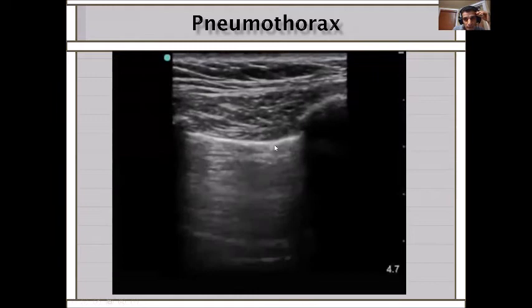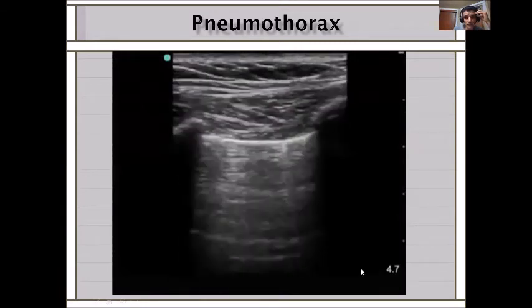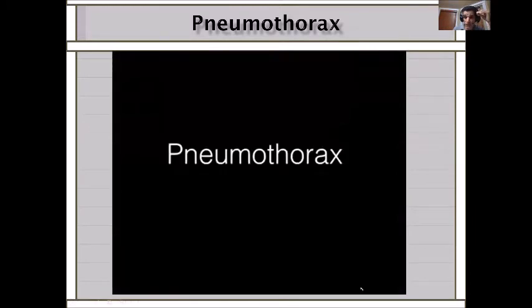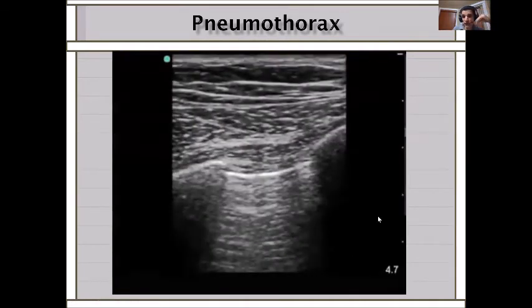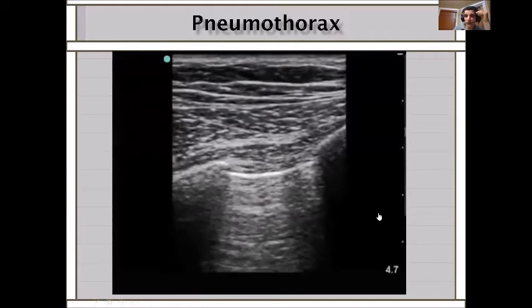Look at this line. Remember this line. Don't look at the whole picture. Look at the pleura and look at this line moving. This one. We'll see more clear. Now look at the pneumothorax. Look, first there are zillions of A lines. There are no B lines. Okay? And there is no sliding. So it's as if a dead picture. You see the B lines that were moving? They're not available. You will learn more, of course. You will see more.